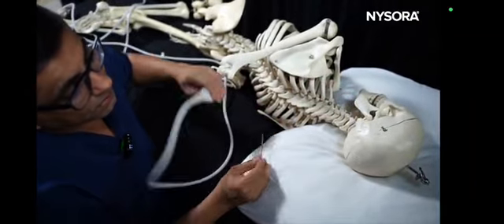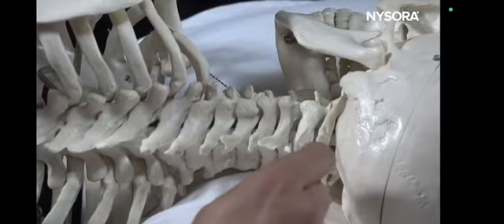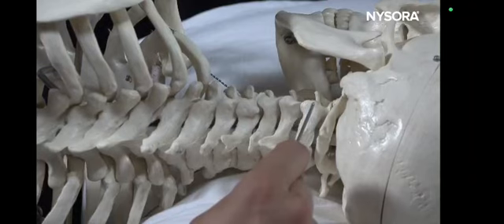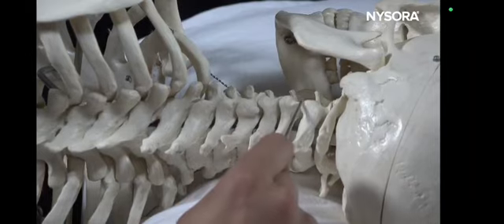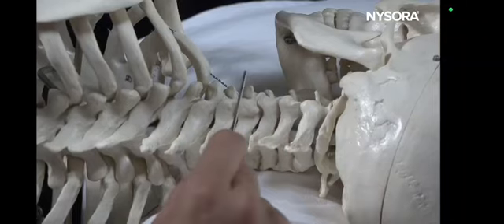So to recap, start with the mastoid process, move down, look for the first joint, which is the C2-C3 joint, look for the third occipital nerve, and then look for the peak and the trough, peak and the trough, peak and the trough. Peak is where you have a facet joint, and trough is where the medial branch is located.